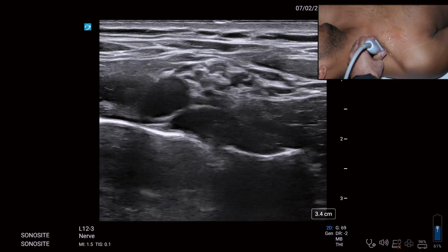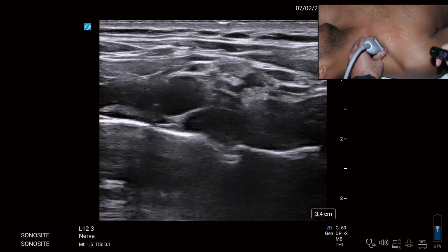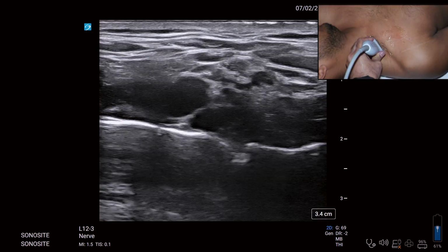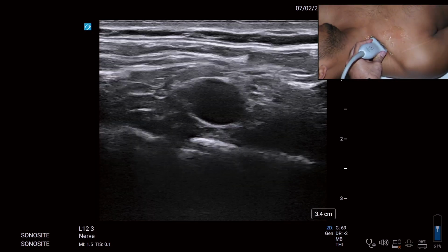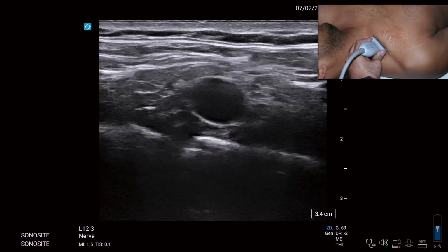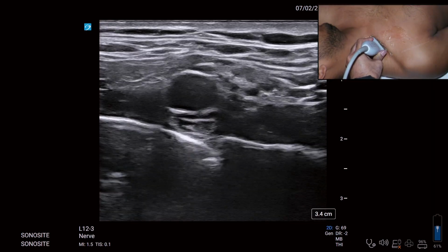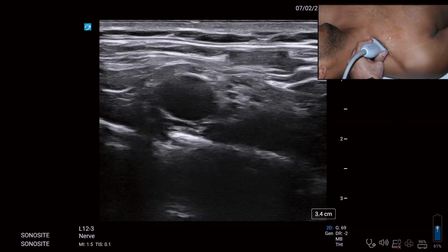Pleura. Would you like to give the supraclavicular at this level? No. What do I need to do? Now it's sitting more on top of pleura, still on pleura. So I need to tilt my probe into the thorax in this case. Where am I sitting right now? On the rib. So if you look at it, this is the perpendicular orientation. I am sitting on pleura. I keep tilting towards the thorax, keep tilting towards the thorax till I am sitting on top surface.